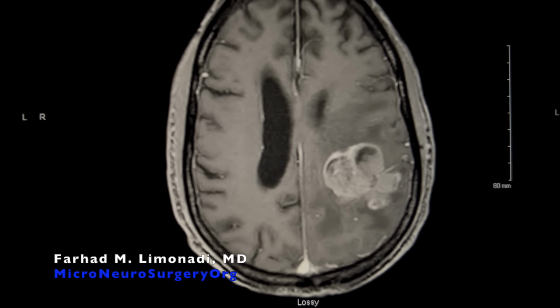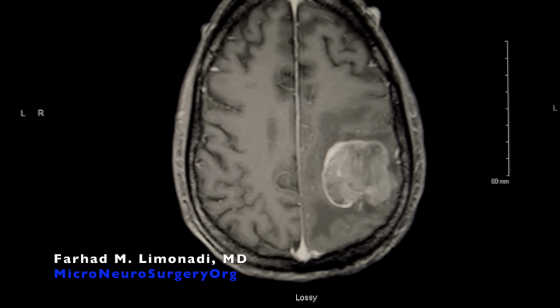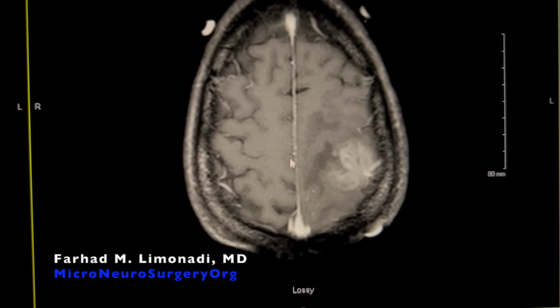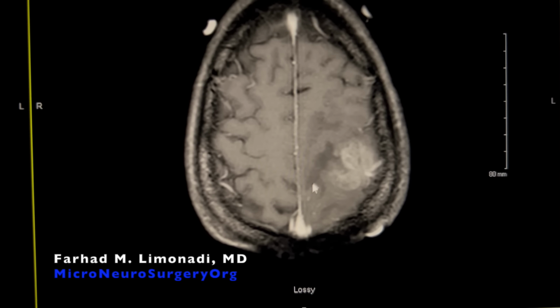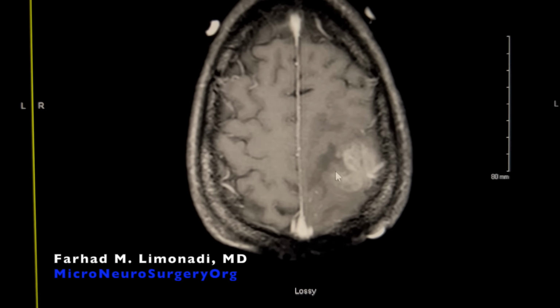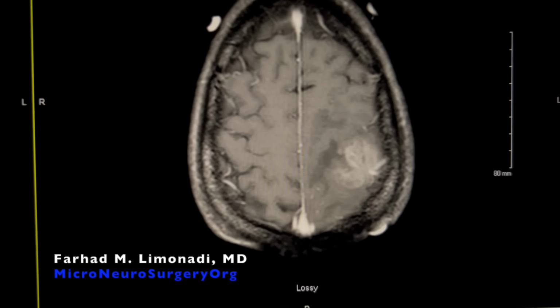Now let's review the MRI slice by slice. Tumor has a lobular morphology with significant local mass effect and edema. Here is pars bracket sign and motor strip. Tumor has completely distorted the anatomy on the left side of the brain.